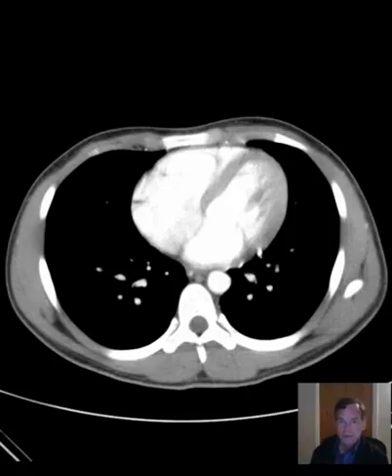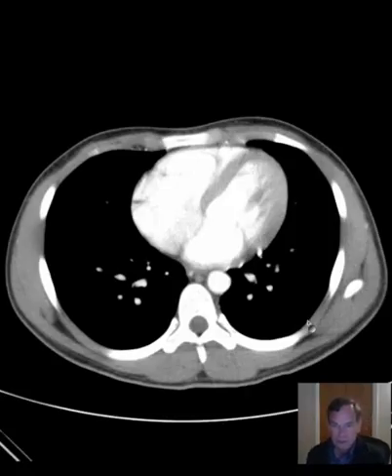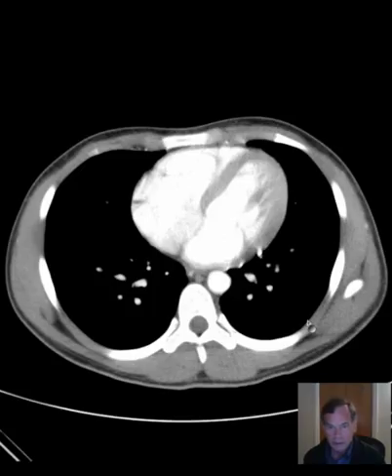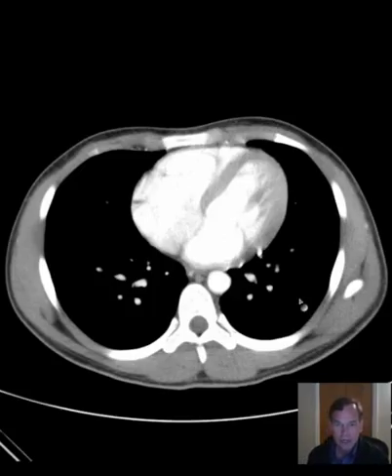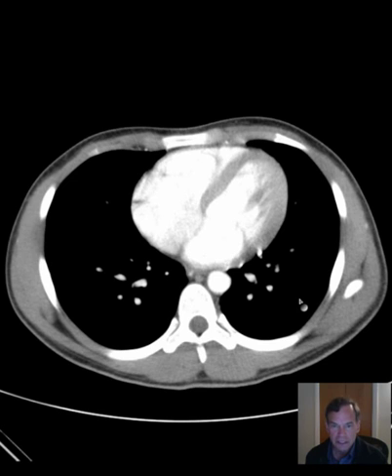Hello there, this is Dr. Mintz. This is a patient presented to radiology for a CT of the abdomen and pelvis with a history of abdominal pain, nausea, and vomiting.